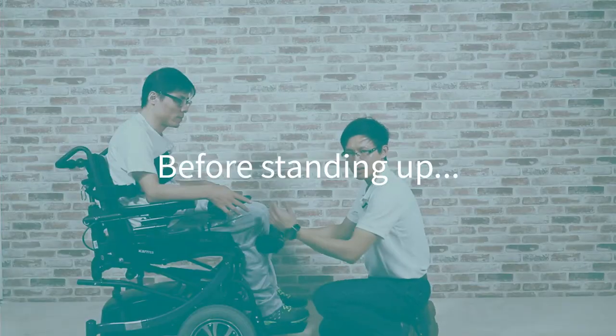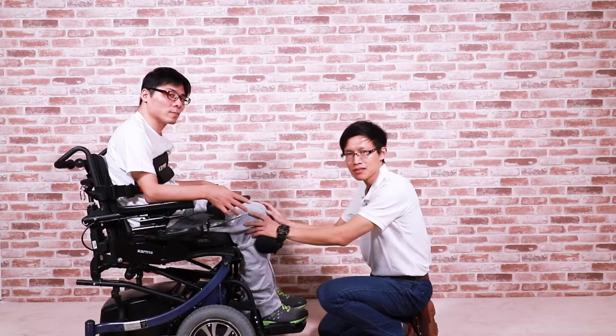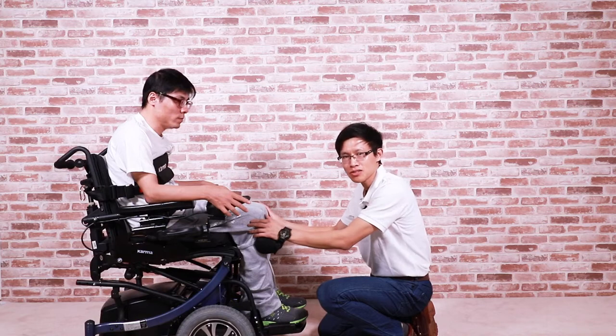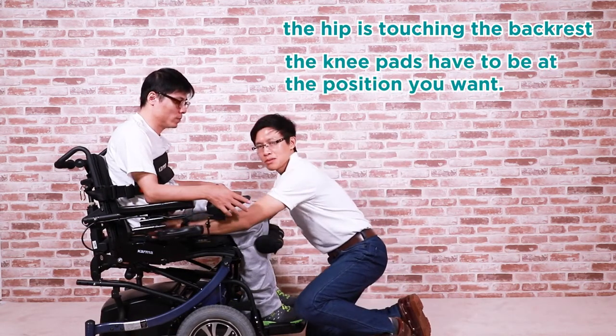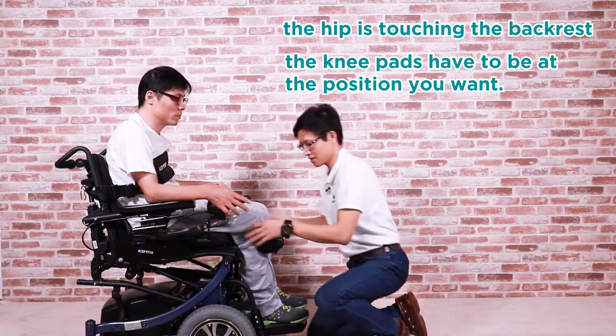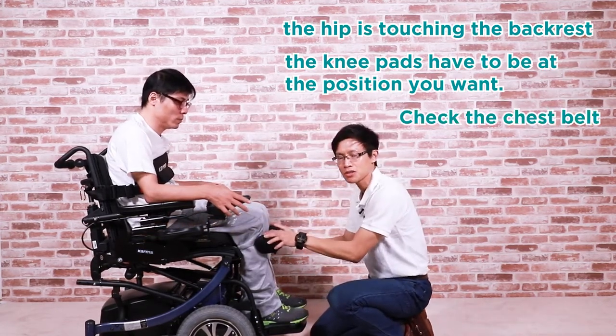Now before standing up, let us make sure the 3 things are in order. Firstly, make sure the hip is touching the backrest and the knee pads are at the position you want. Check the chest belt too.